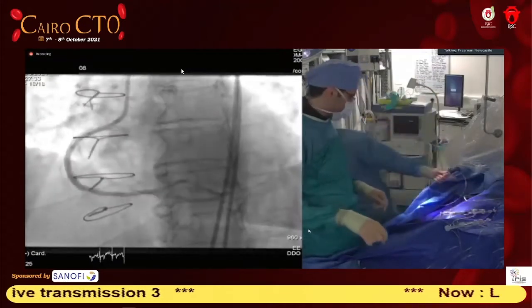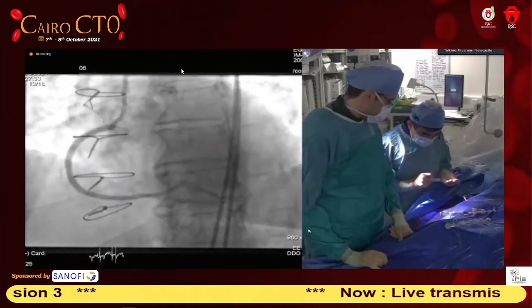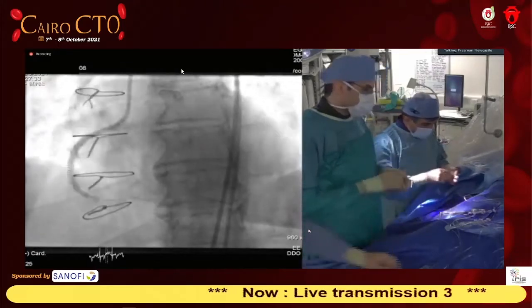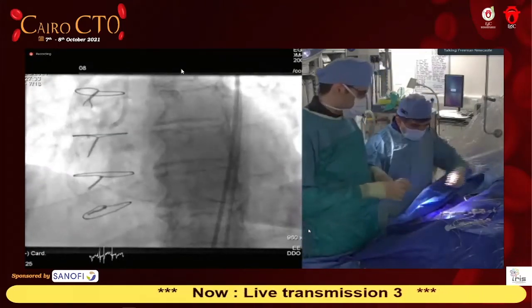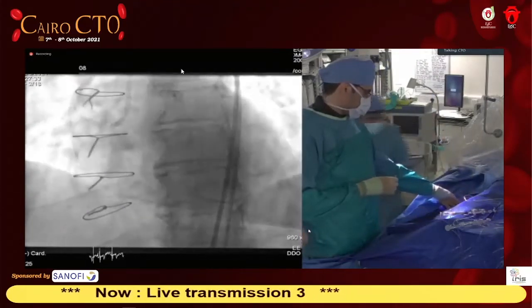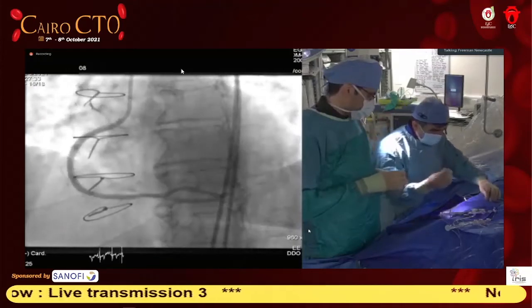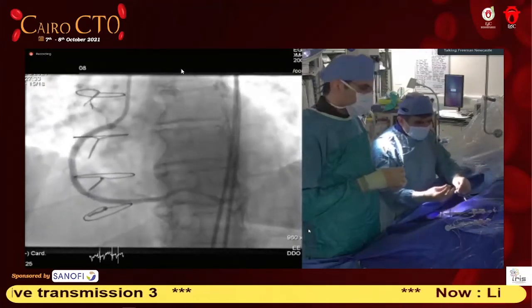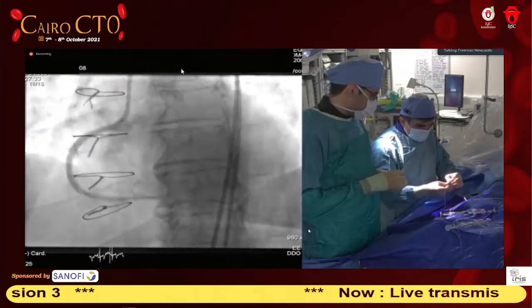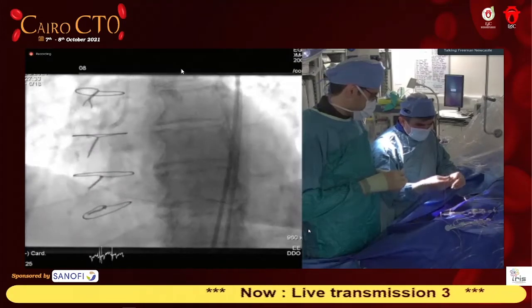In cases where you have a perforation, you need to position your catheter really where you want it, because if the coil comes out in the wrong place, you could end up with more problems than you solve. What is the size of this? Yeah, this is almost the same as the Fine Cross, but the lumen is a little bit bigger because this one is slightly thicker than the Fine Cross. We use this because I use the Boston Vortex coil.